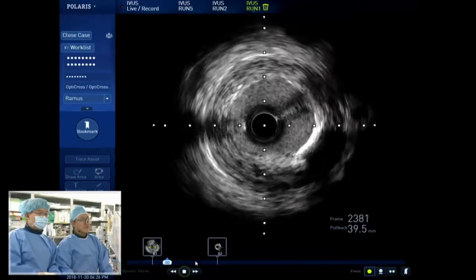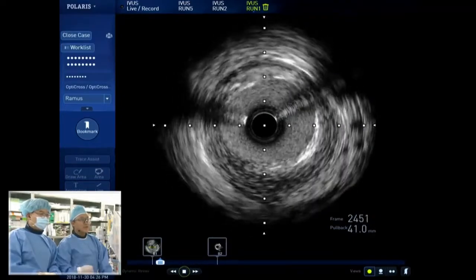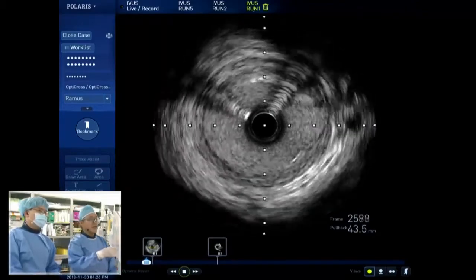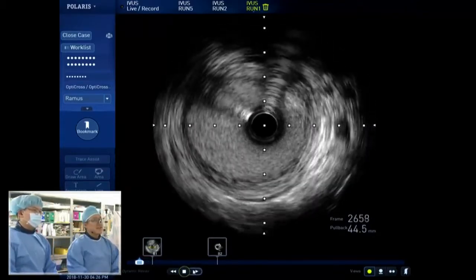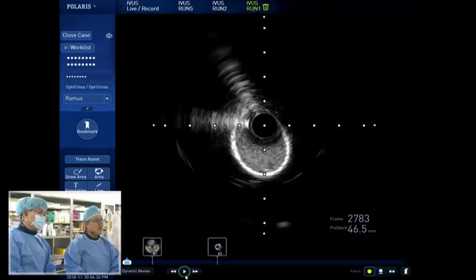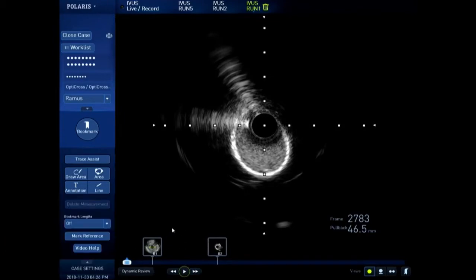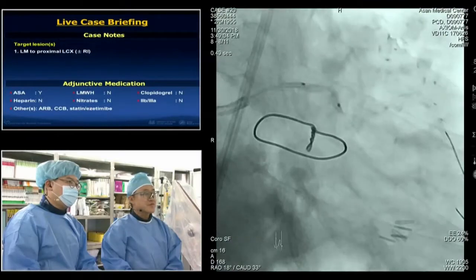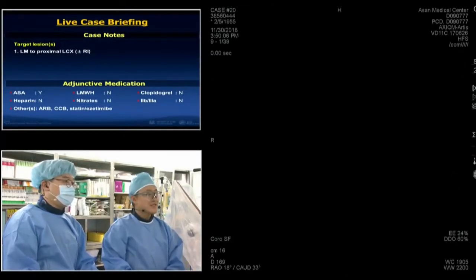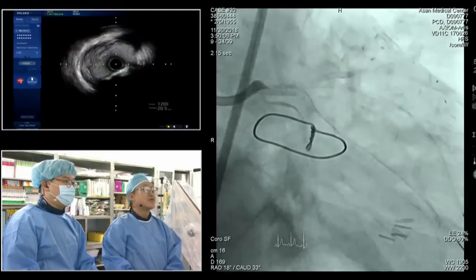And then it was successfully wired, but the passage of the IVUS doesn't work because of severe calcification. And then next, at first we performed, this is 3.0, a 2.0 compliant balloon, which doesn't work. Next, and this is the 2.0. Next. Would you show us? Okay, good. Yes. This is a 2.0. Okay, the encircling narrowing calcium portion is the distal left main area, right? Yeah, definitely. Right. Yeah, and then next.